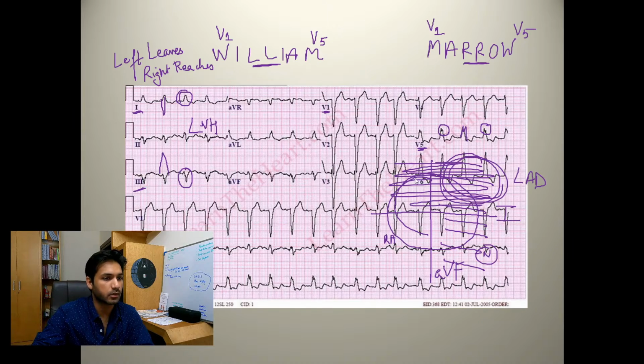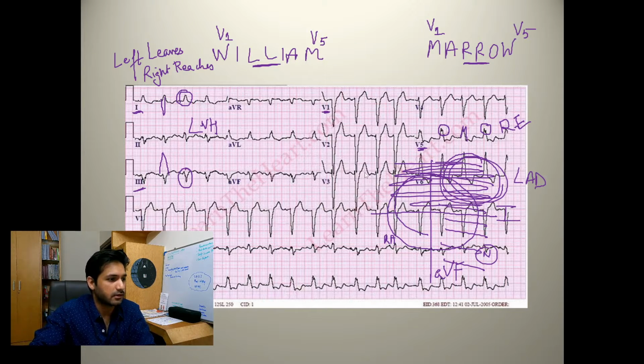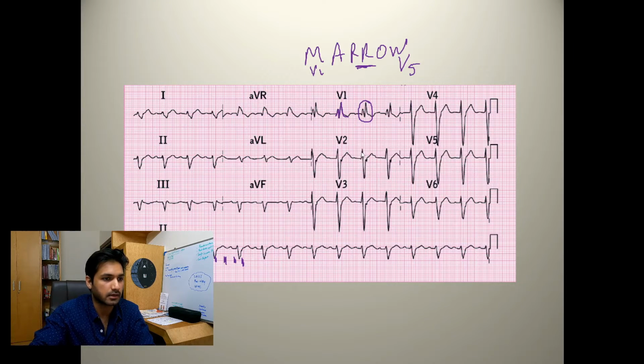One thing that I want to point out is that these M waves are given the name of rabbit ears. Rabbit ears. Now, I don't know, these don't look like a rabbit ear to me. Over here, yeah, maybe, but sometimes rabbits have droopy ears, so I don't know. That's just what's written in the literature, so I thought you would like to know that.